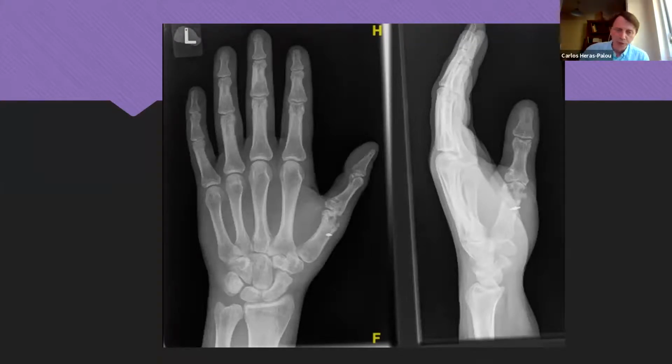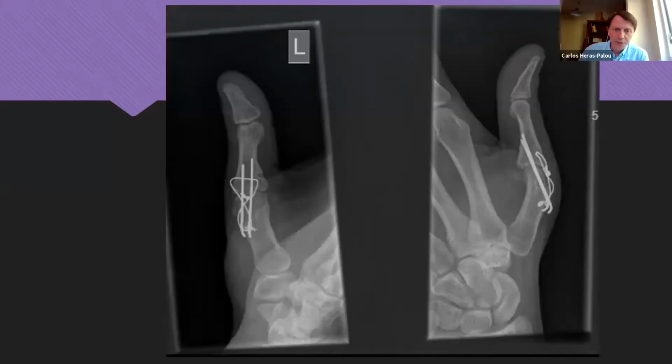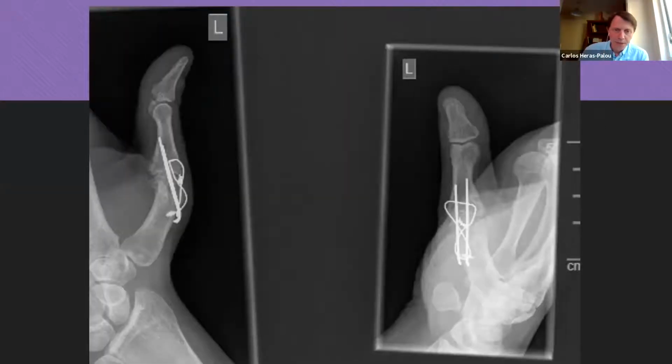Here it is a little bit more difficult because you want to fix it at about 10, 20 degrees of flexion. So it makes it more difficult to use a tension band wire. And that's why more people use a plate for this. But I did that and I thought it was all right. Looked okay, but it didn't heal. Pain was okay, but he still, when he pressed, it was bothering him.